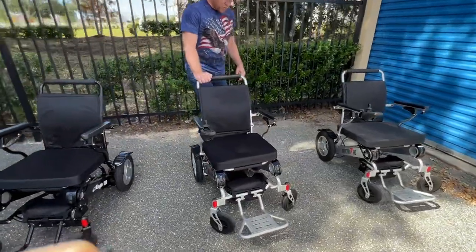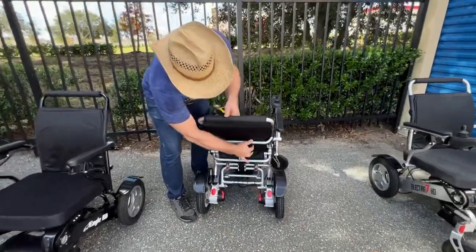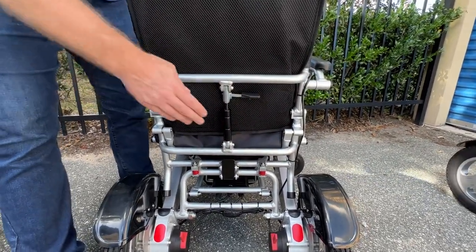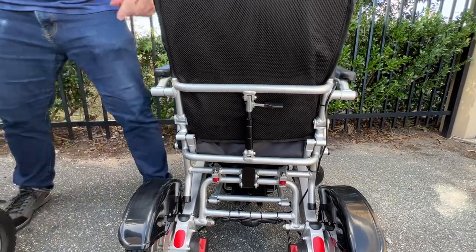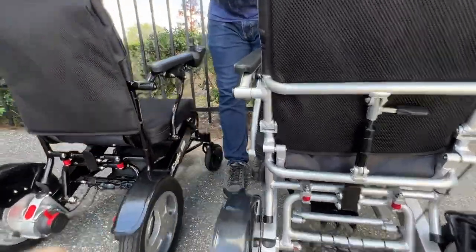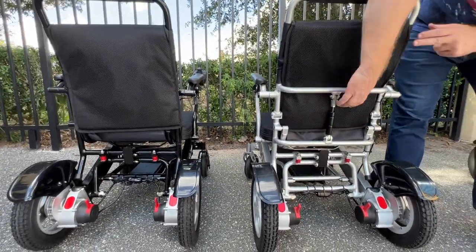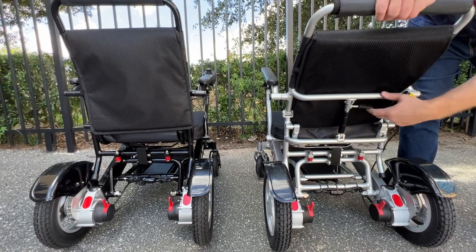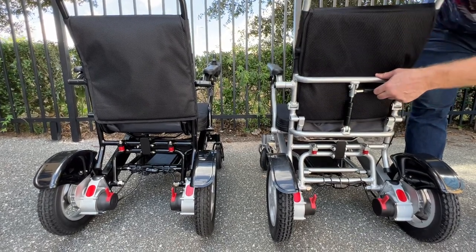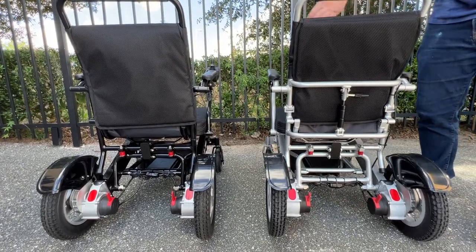There's one difference between the two chairs — the Falcon reclines, the Eagle doesn't. The Falcon is four ounces more in weight than the Eagle. Looking at the back of both chairs, the Falcon has an ergonomic reclining mechanism — an infinity recliner — so you don't see preset notches or anything like that. All of these chairs are built with aircraft grade aluminum.